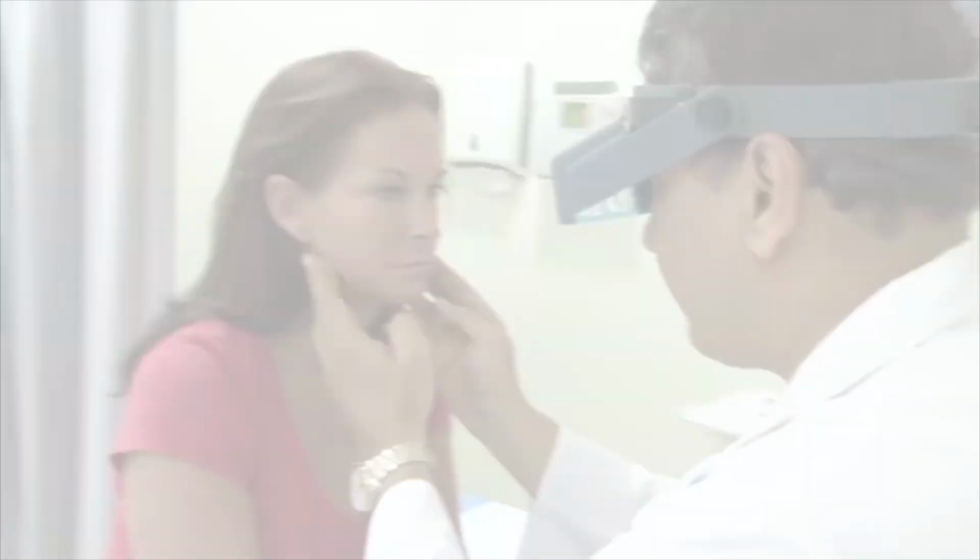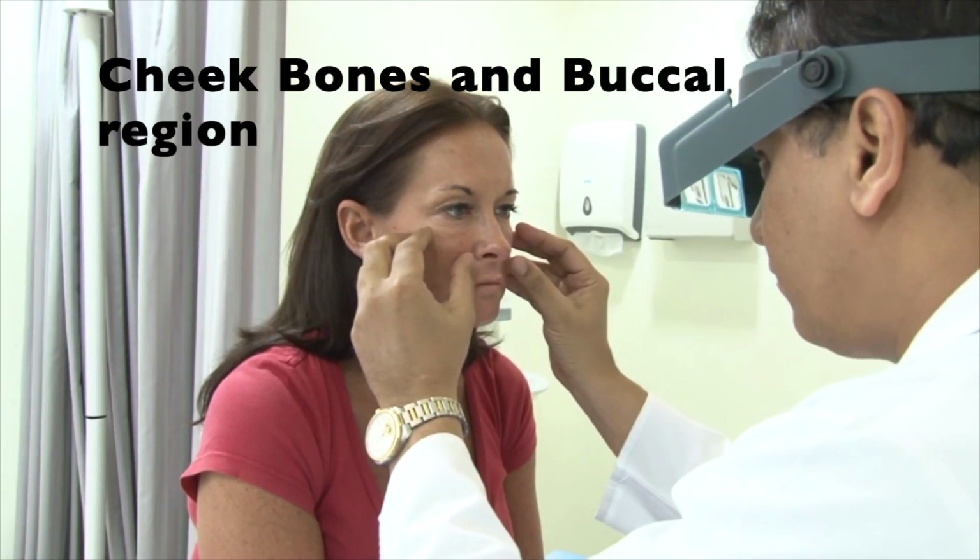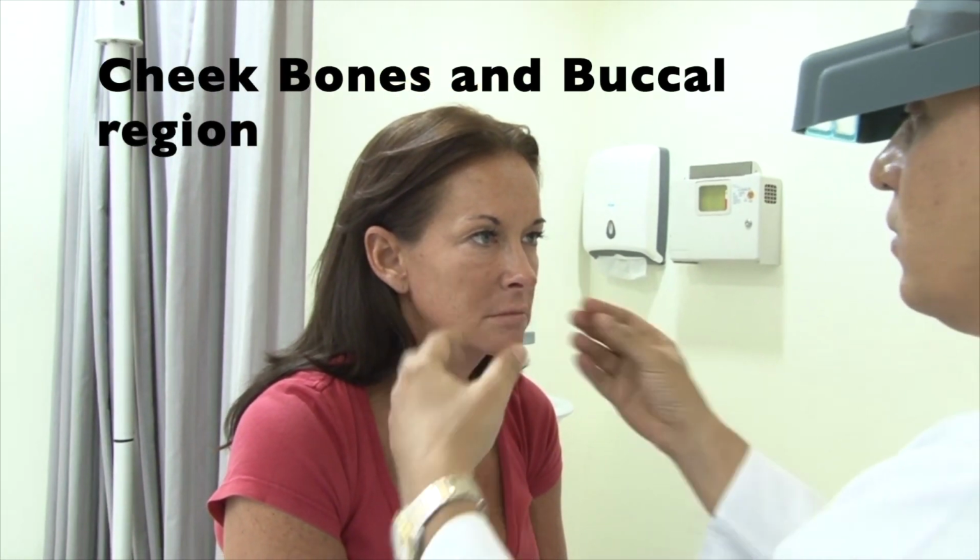Okay. Now you do have good tone here actually. You haven't lost a lot of tone. So there's not much sagging, but you have lost volume. There's some volume loss in what you call the suborbital area here. Some volume loss in the cheek area here, or the malar area. There's a little bit of laxity in this one.